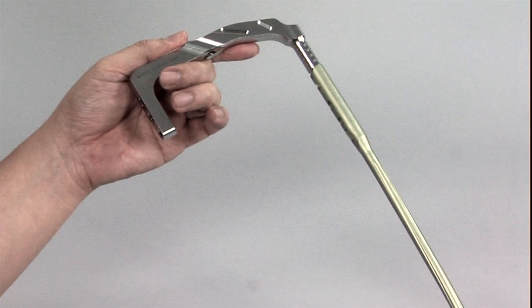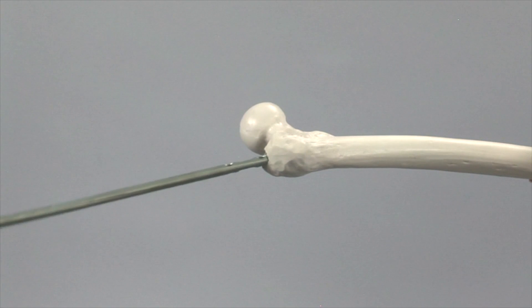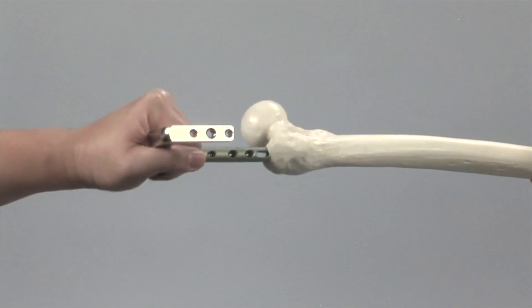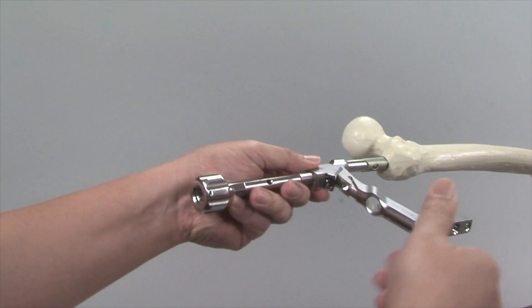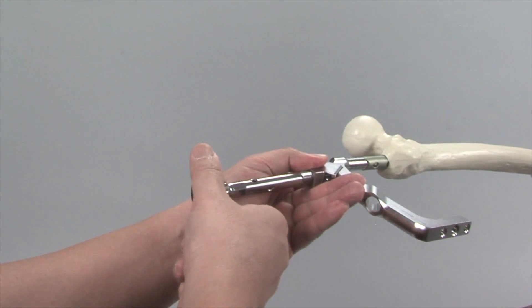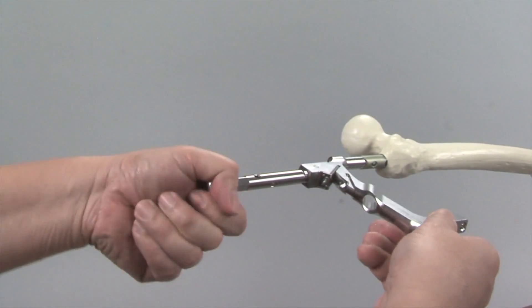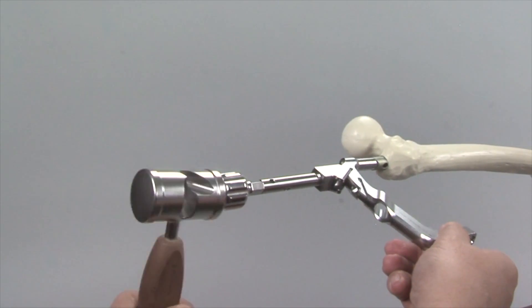The guide wires along with the sleeves and aiming arm are removed. With the patient positioned supine, the insertion handle initially points towards the ceiling. The nail has spiral flutes on its surface to help rotational movement during insertion. When the nail is advanced into the bone it rotates 90 degrees, and the insertion handle now points to the lateral side. If the insertion cannot be completed manually, the connector is attached to the insertion handle. The slot nearest the nail should be used so that the connector lies parallel to the nail for easier insertion; this places force more in line with the nail. The nail is advanced with gentle blows of the hammer. The insertion handle itself must never be struck directly.